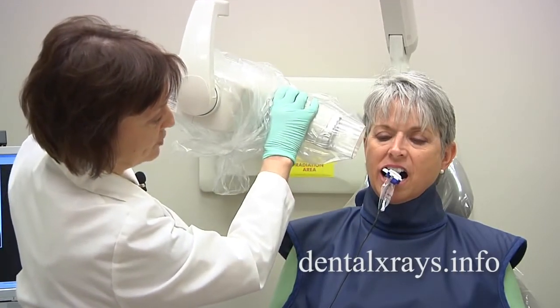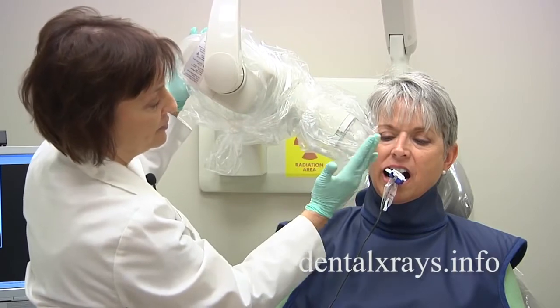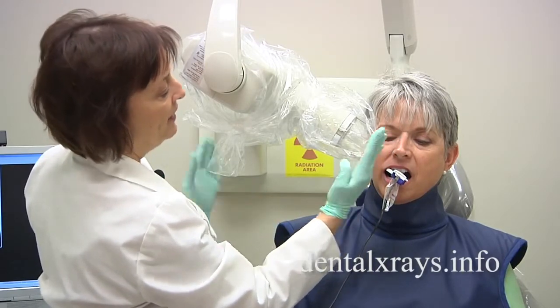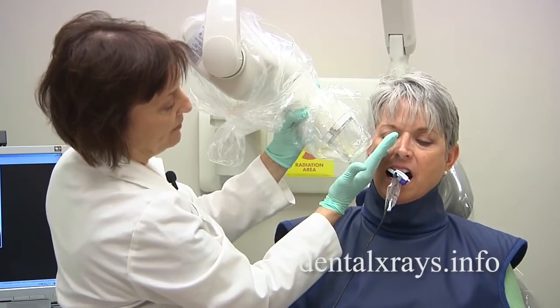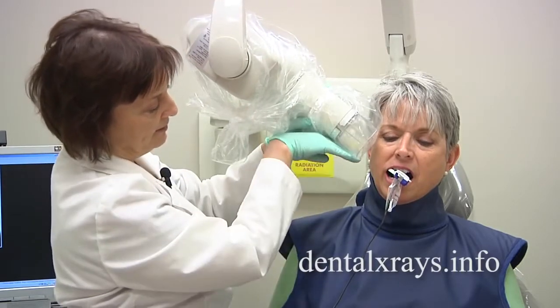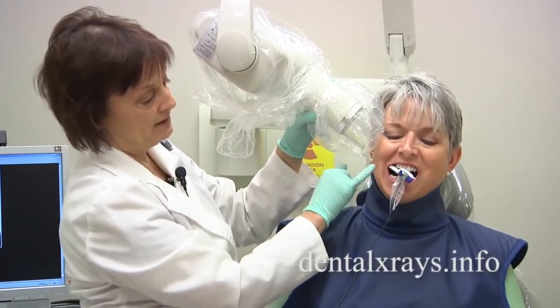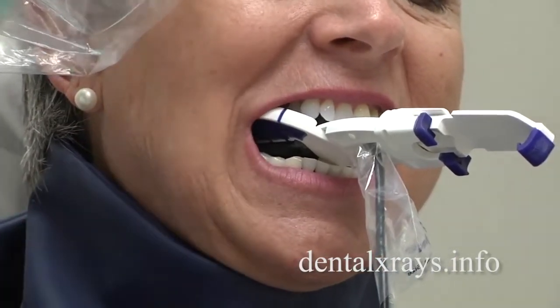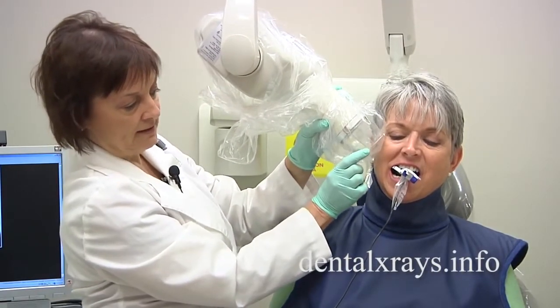You're going to bring this up to determine the angle of the sensor, the long axis of the tooth, and about halfway is where you're going to guide your x-ray beam to be perpendicular to the bisected line. A close guide is: if you can see your sensor in the mouth, bring your cone up to meet at a right angle to the film and then bring it back a couple of degrees — then you will be crossing that bisected line. The bottom edge covers the sensor, the side covers the front edge. There's a little purple line indicating where the front edge of your sensor is, so if you bring your cone right to that purple line, you won't be missing the front edge of the sensor.